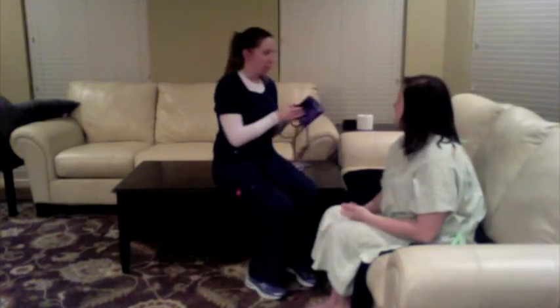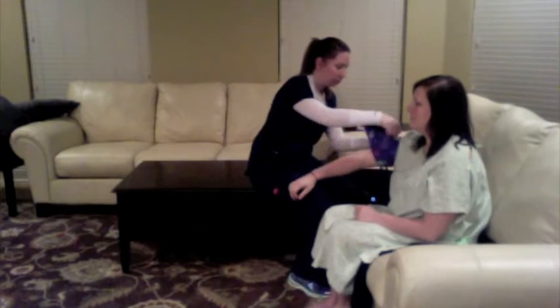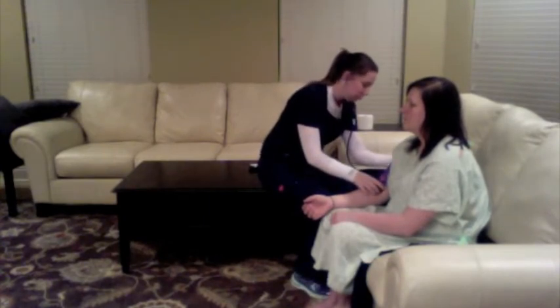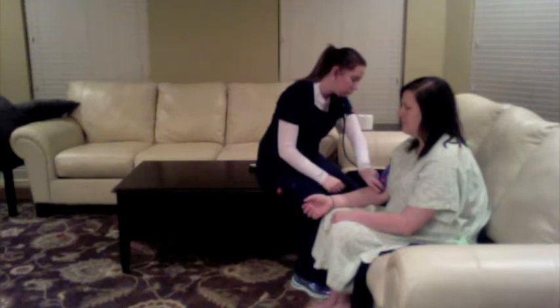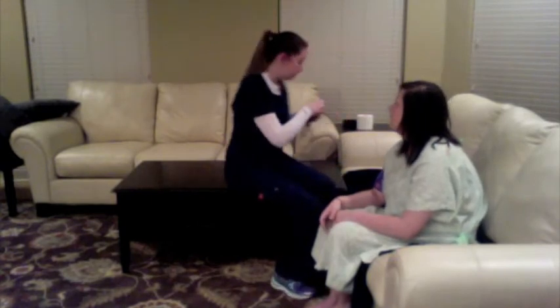Let's get started. I'm going to get your blood pressure. Do you ever have high blood pressure? Yes. Okay. How long have you been dealing with high blood pressure? 6 years. Okay, let's see what it's like today. Just relax for me. A little high, 162 over 84.